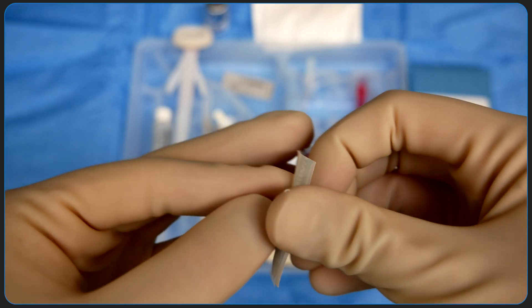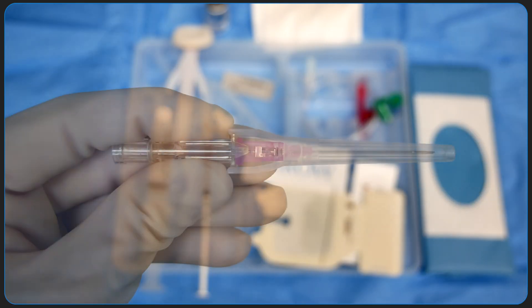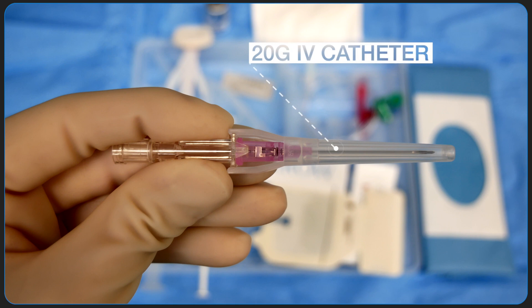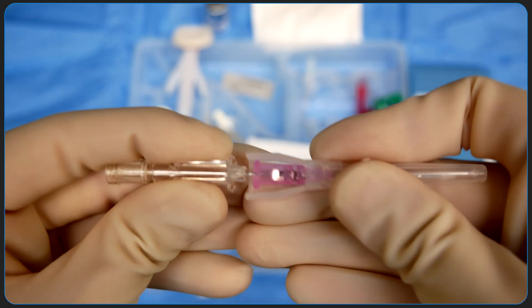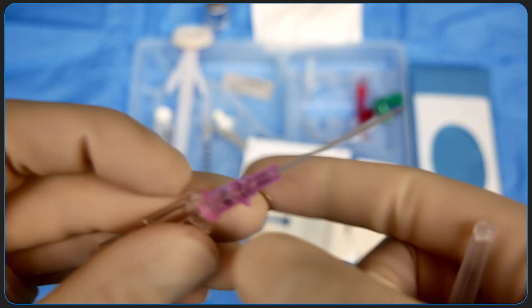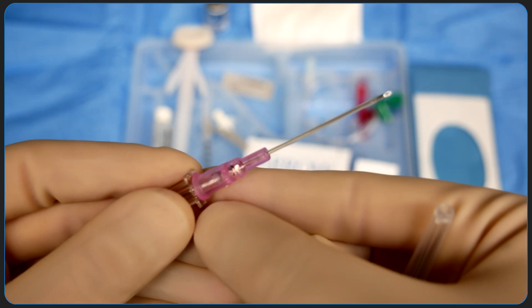Next up is the 20 gauge IV catheter. This is the actual needle that we use to puncture the artery. This catheter can actually be connected directly to the arterial line transducer, or sometimes we'll exchange it for an alternative indwelling catheter using the Seldinger technique. We also have integrated arterial catheter systems that combine all of those pieces, but I'll show you that in a separate video.